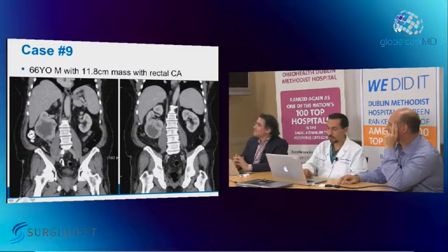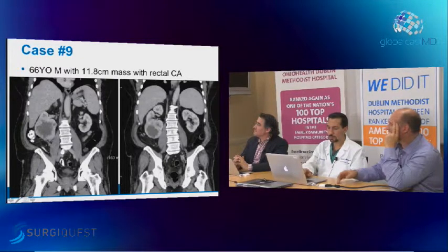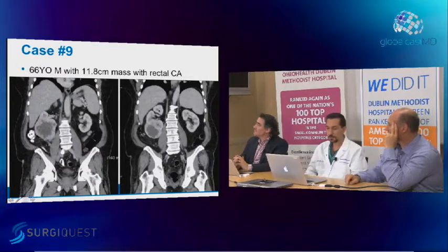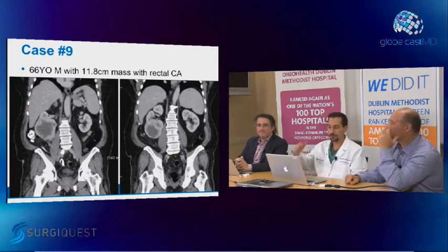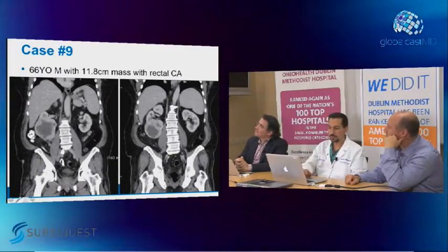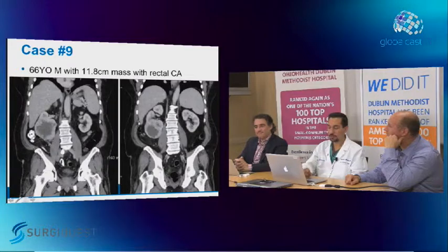If you look on the right, though, you can see that this is predominantly a lower pole tumor. Yeah. So it did continue pretty much all the way down to his ASIS. It was quite large, but there was a good amount of lower kidney. If you look at the image on the left, it looks like he has no kidney left other than a little nubbin. But you're saying there's more kidney there? Oh, yeah. That was just more anterior. But as you went posterior, you see this normal appearing portion of kidney up here.